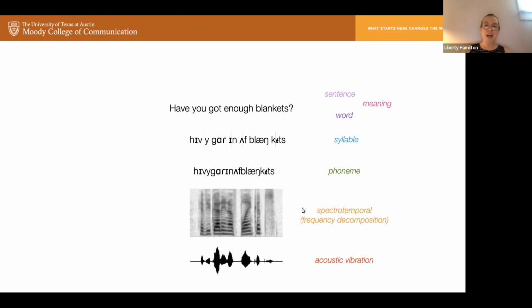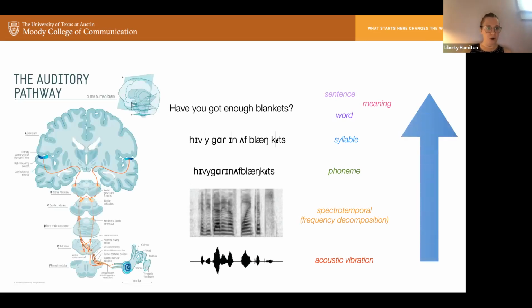And so with some of these data sets, if they include additional information with annotations for these different events, then this can help you look at encoding of specific aspects of sensory processing, whether that's speech and language or whether you're interested in something completely different. Okay, so this is thought of as a bottom-up process and involves kind of the whole auditory pathway.